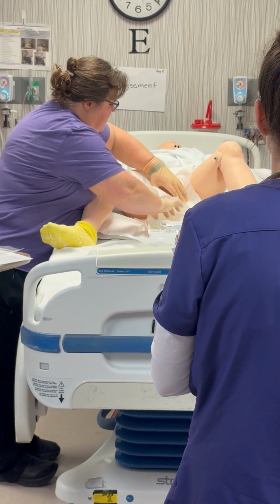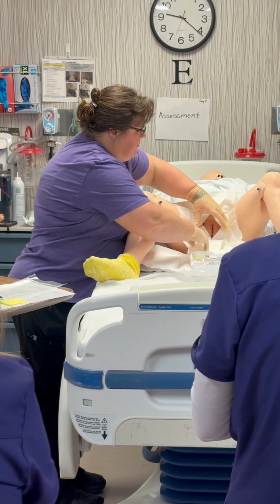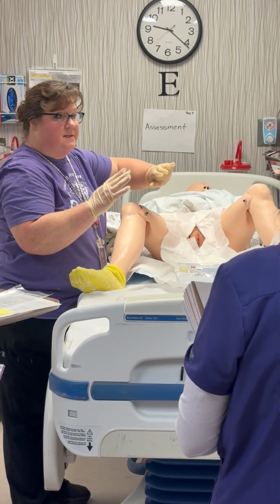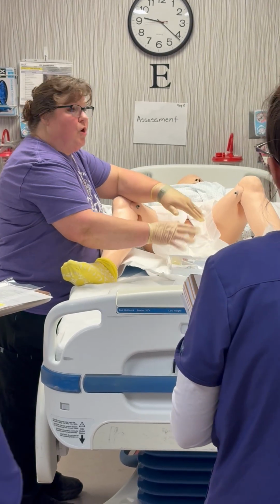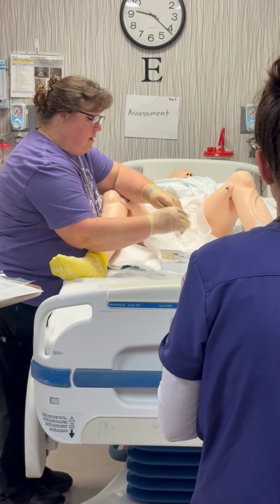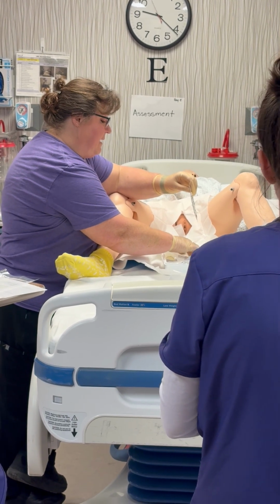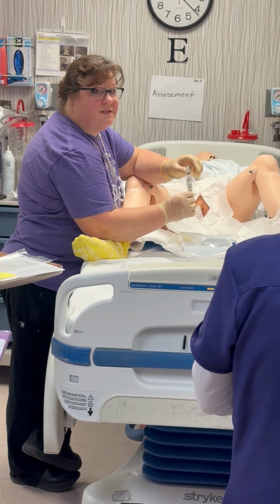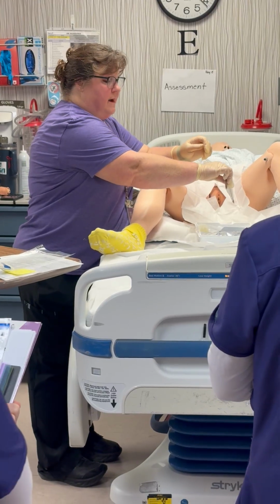Remembering where my 1-inch border is. Okay? See that? Okay. Did I unsterilize myself at any time? No. Okay. So now I've got those down, and now I'm just going to open everything. Okay? So, first thing is my betadine. So we are not really going to open up my betadine in the LRC here. Because as you did the bed bath and everything, you saw some of those stains. It stains the mannequin, it stains the bed.